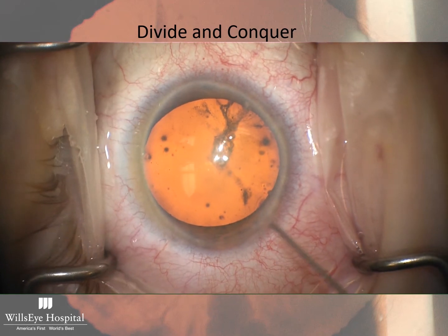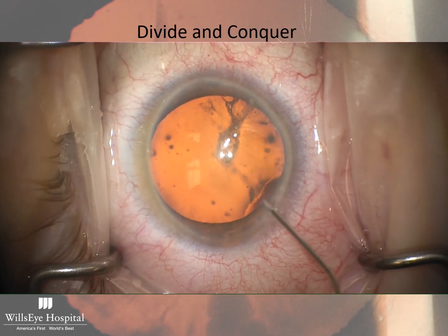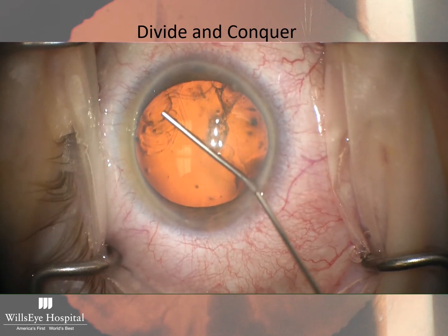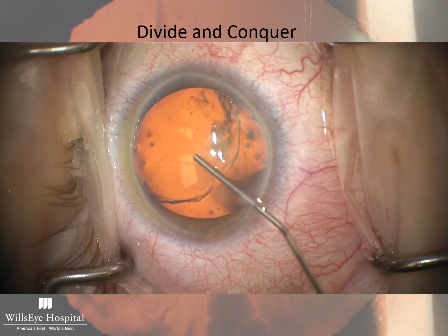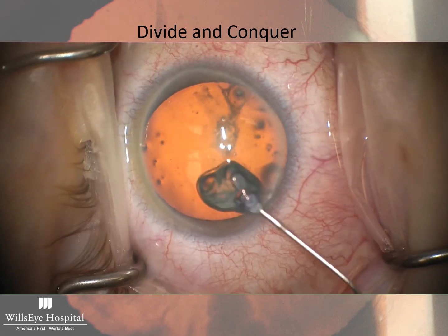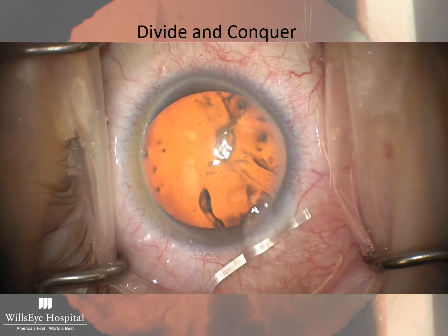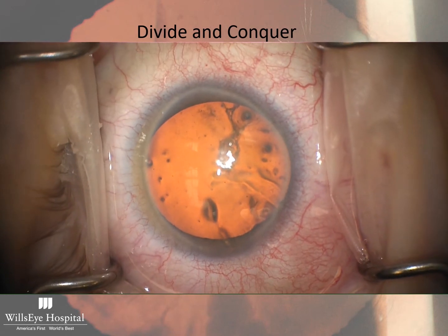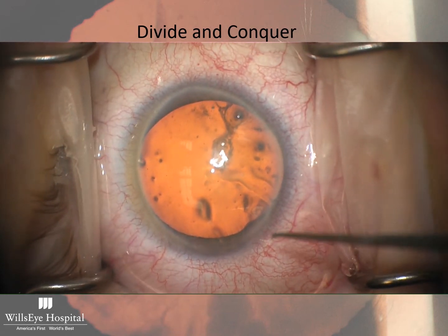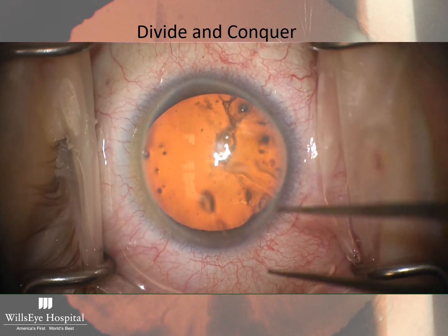So following this, we're going to inject viscoelastic into the anterior chamber, create an initial bolus, and then I head distally and allow the viscoelastic wave to push fluid out of the eye. So once some viscoelastic comes out, I know I've pressurized the eye. I'm not going to get any more in. And I can go ahead and proceed with my main wound.